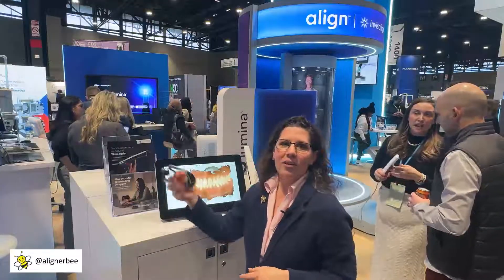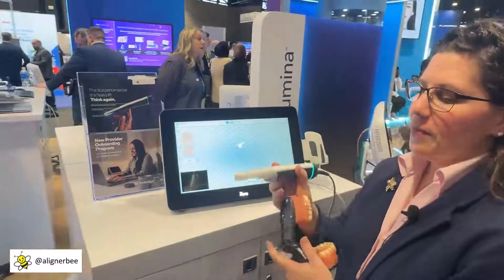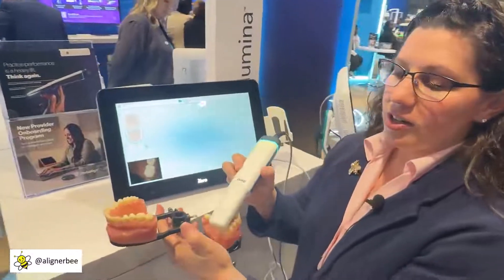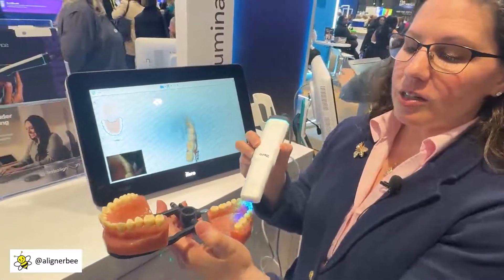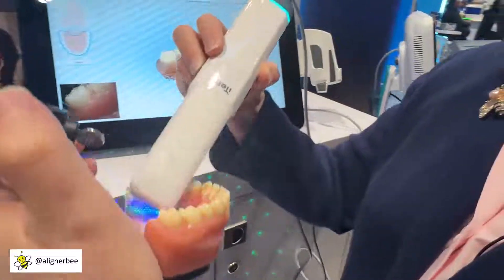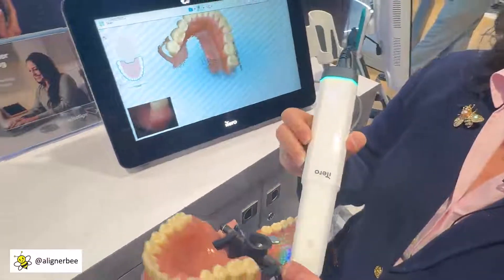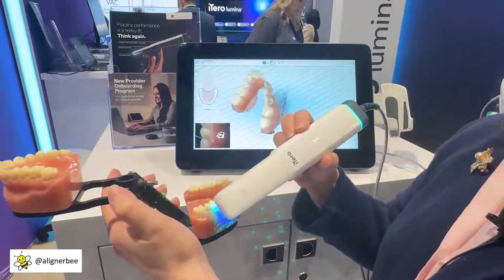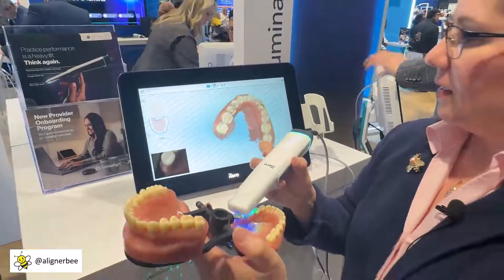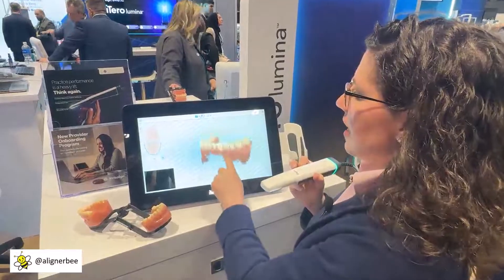Let's take a look at our intraoral scans. I'm going to begin by scanning the lower arch, which I've selected in the software. I'm going to hold the scanner with a pen grip and begin to scan the lower arch. One of the interesting things I learned is that because of the six cameras, they actually want you to hold the scanner away from the teeth to capture a larger area. As you can see, I've made one pass over the occlusal, one pass over the lingual, and one pass over the buccal — and we can see how much I was able to capture in that single pass.